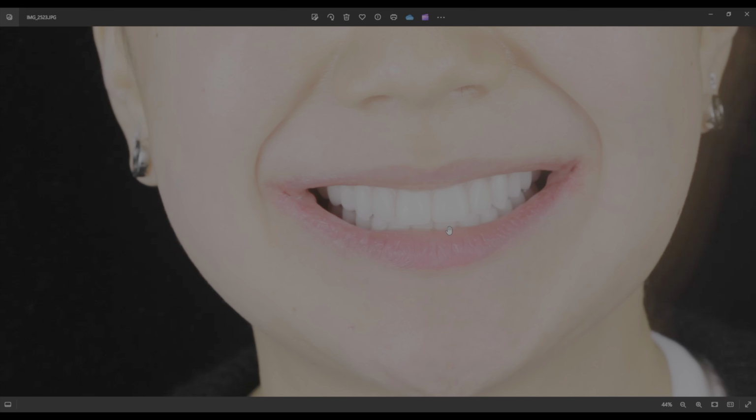Okay, so this is what she looks like afterwards. We were able to do the occlusal bone reduction and support it with implants so that she could get her back teeth, and so she wasn't going to look like that other patient we started the video with, where we saw only canine to canine, which for her, being a 37-year-old attractive female, would have been a catastrophe, right?